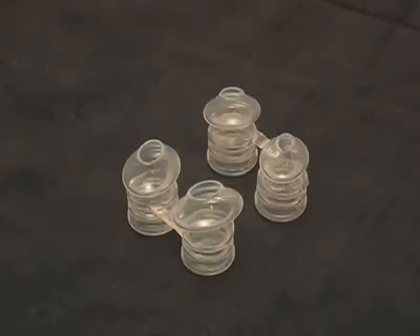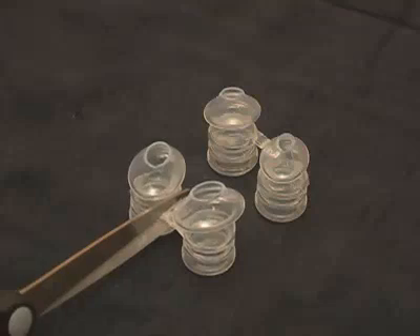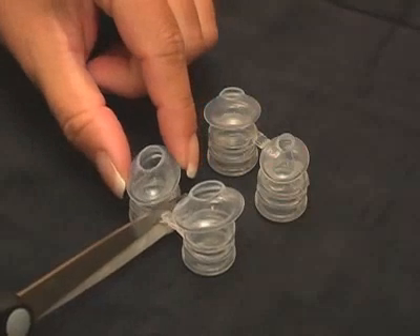In order to accommodate patients with different sizes between the left and right nostril, the pillow sets may be separated. To separate a pillow set, cut the adjoining silicone bar in the middle.